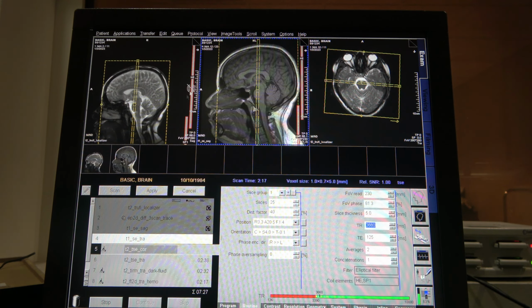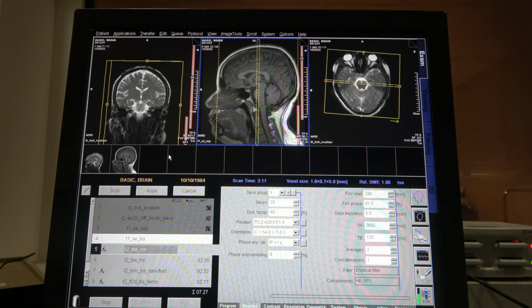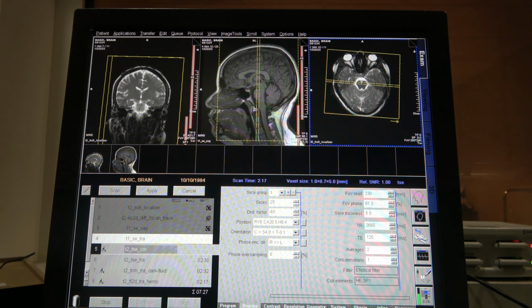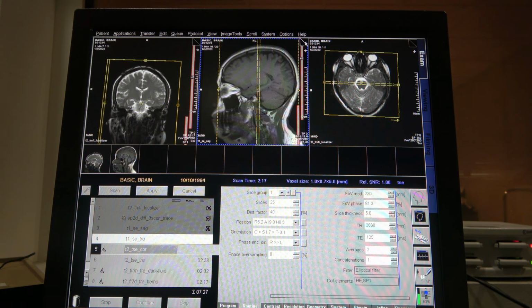And then we're gonna bring a coronal. All right. And I like to be nice and parallel with the middle of the brain. You see that? Bang. Okay. All right, here it's gonna be perpendicular to the middle of the brain. Something like that. All right. And a way to find out if you're gonna get all the images that you need, because we want the whole brain, is you can scroll through it.